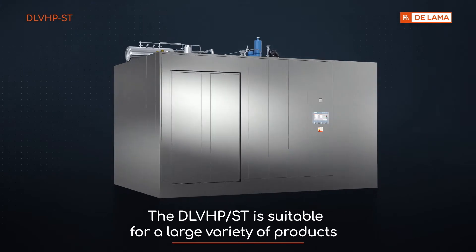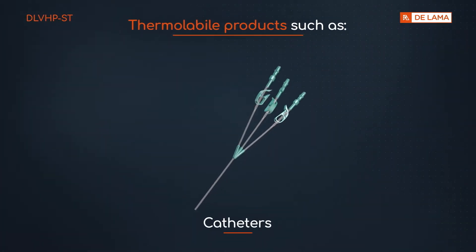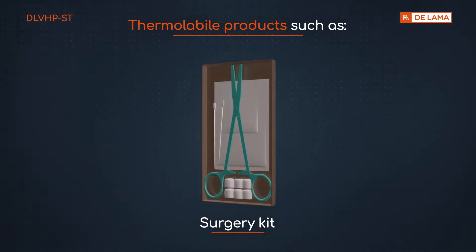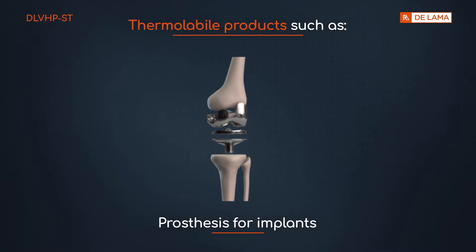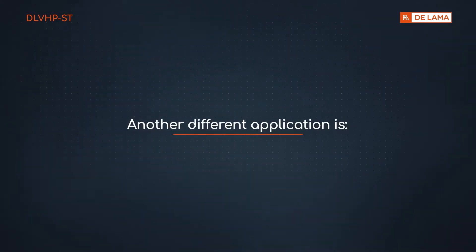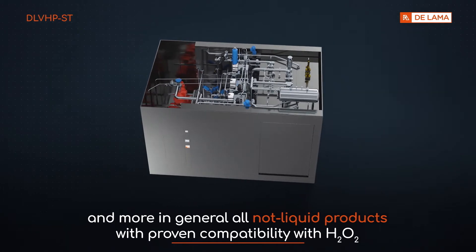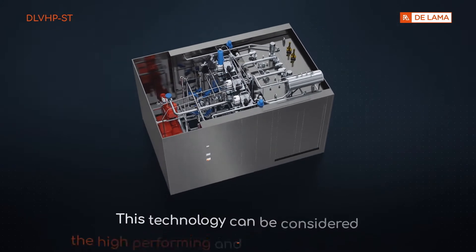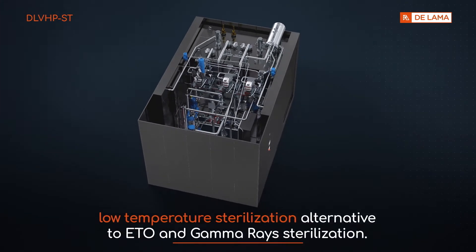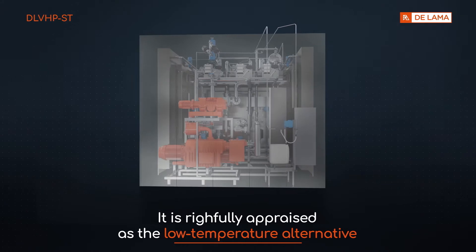The DLV-HP-ST is suitable for a large variety of products: thermolabile products such as catheters, intracardiac catheters, surgery kits, single-use medical tools, prostheses for implants, and multi-component implants such as cochlear implants. Another application is packages for thermolabile filled containers, and more generally all non-liquid products with proven compatibility with H2O2. This technology can be considered the high-performing and environmentally friendly low-temperature sterilization alternative to ETO and gamma-ray sterilization, and is rightly appraised as the low-temperature alternative to traditional thermic steam sterilization for all non-liquid materials.